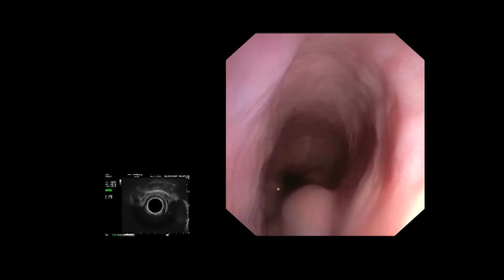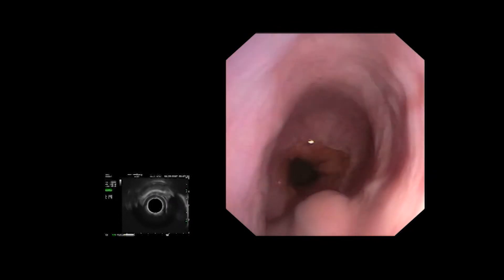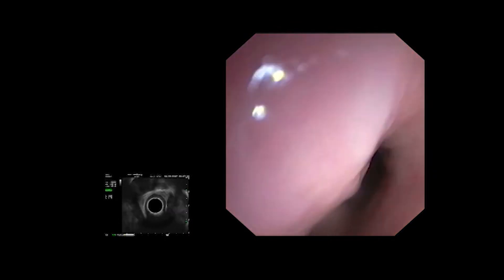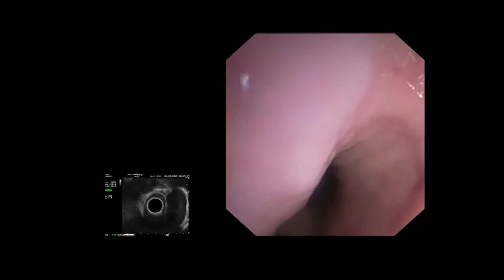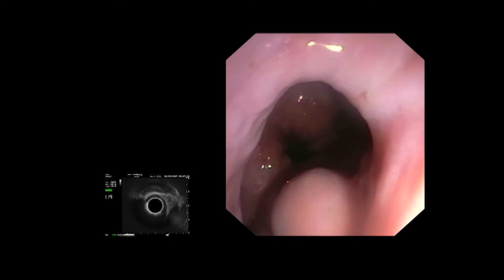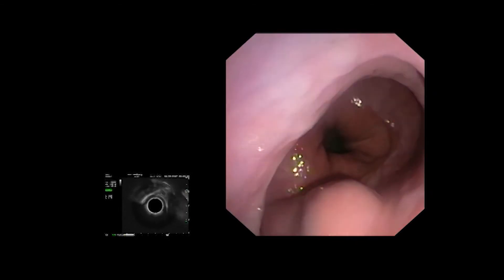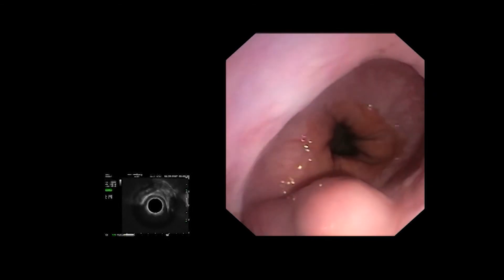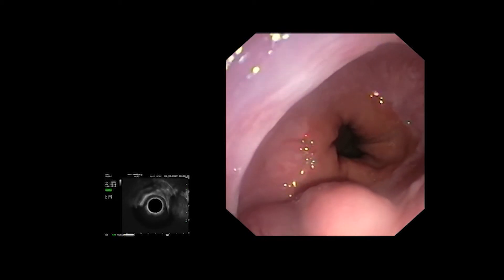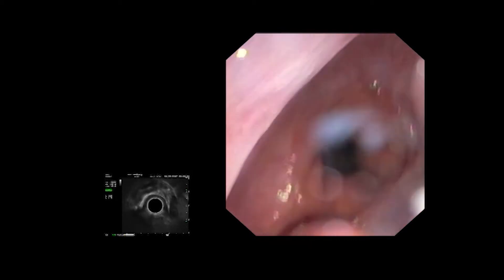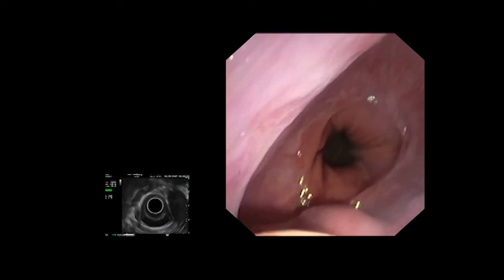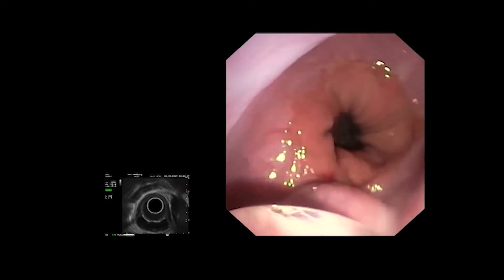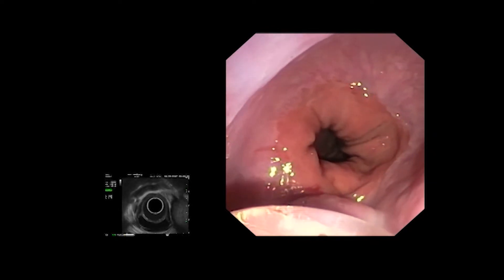The endoscopic ultrasound device is approaching the distal submucosal tumor. The endoscopic appearance is caused by the oblique lateral view provided by the EUS device. The balloon is inflated, the EUS image is then displayed, and a search is made for the location of the tumor.